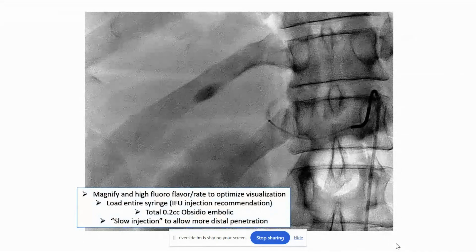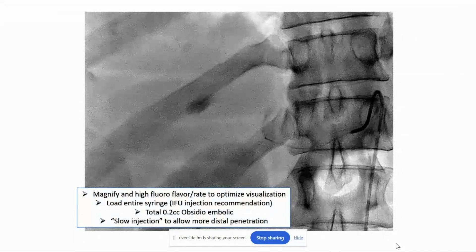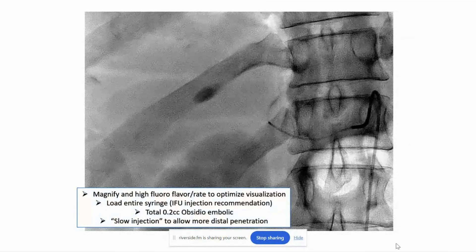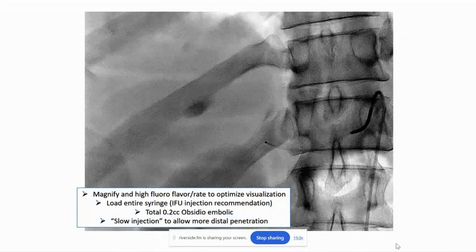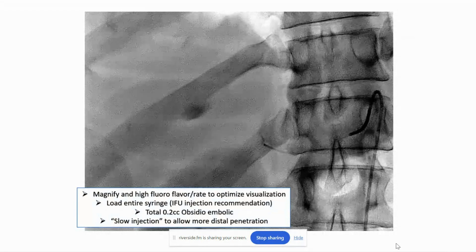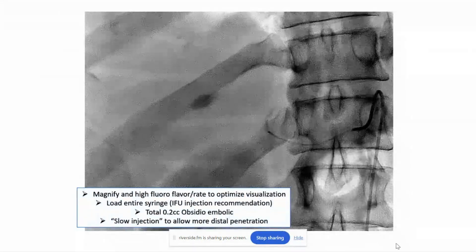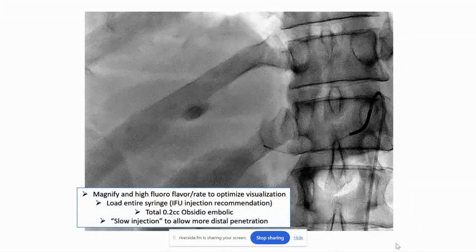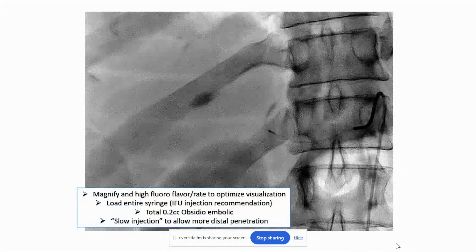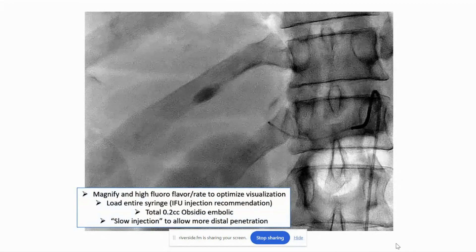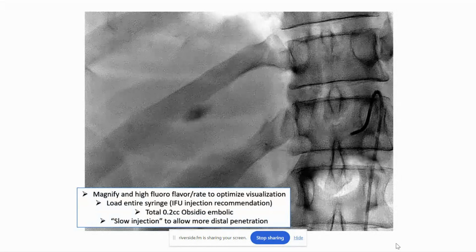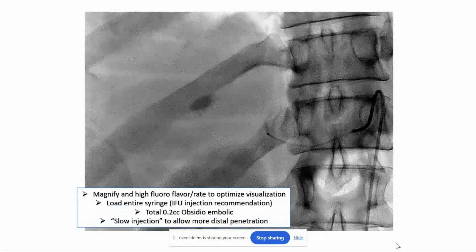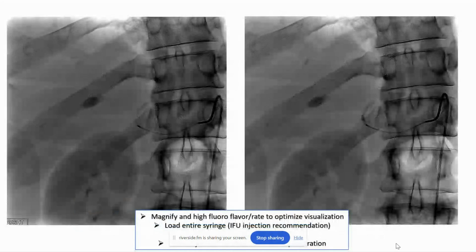In this case, as you can see here, it takes a really small amount of embolic, about 0.2 cc's. And it's a little bit paradoxical — the slower you inject, the more distal the penetration; the harder you inject, it actually sort of comes out and plugs up the vessel like a plug.